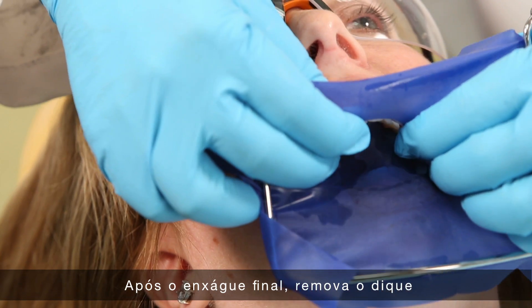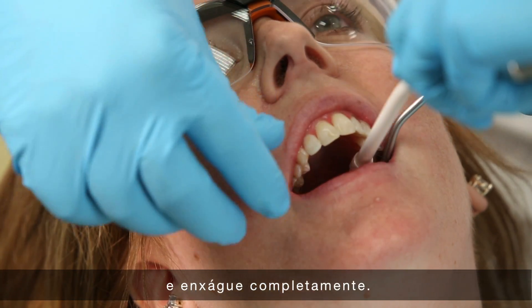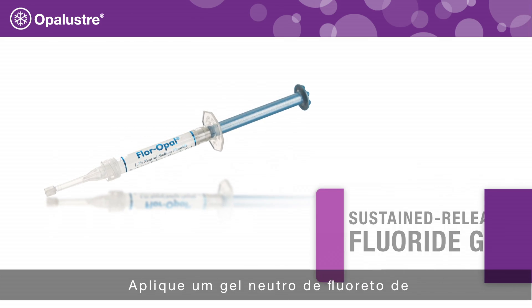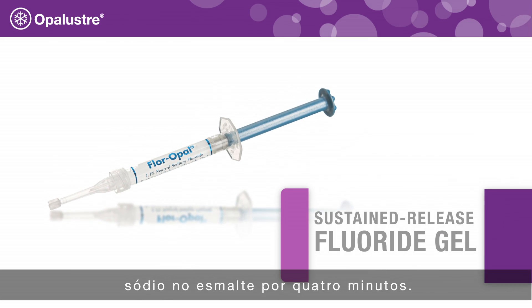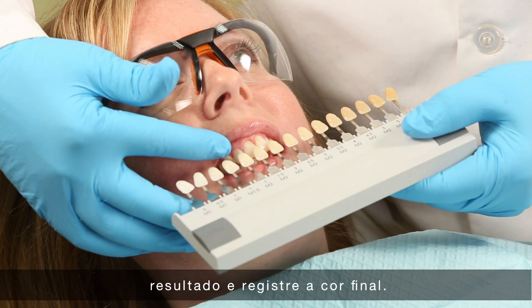After the final rinse, remove the rubber dam and sealer from the teeth, then rinse thoroughly. Apply a neutral sodium fluoride gel to the enamel for 4 minutes. Remove fluoride gel, evaluate teeth, and record the final shade.